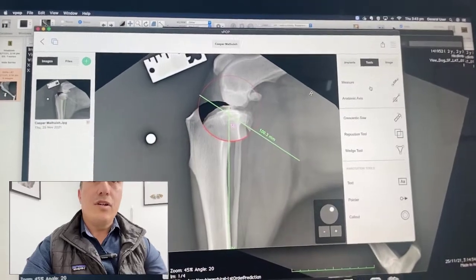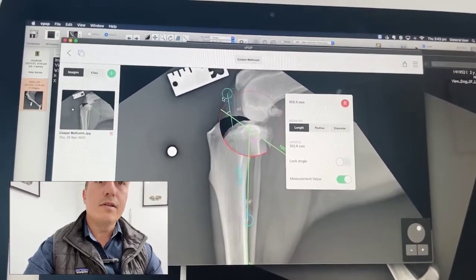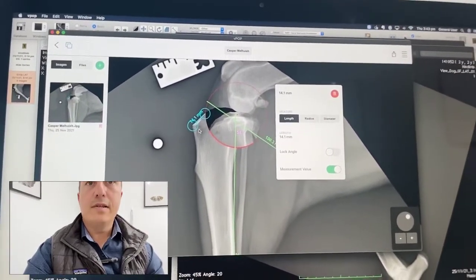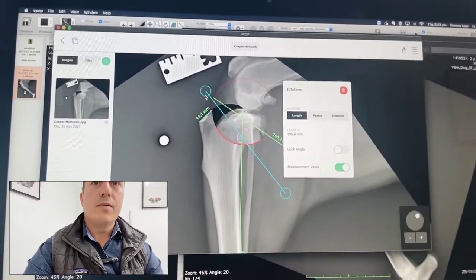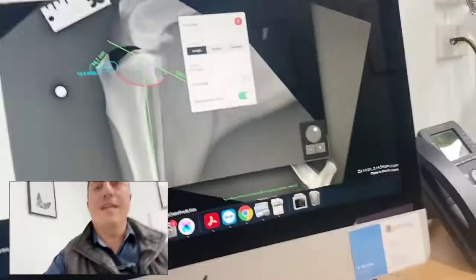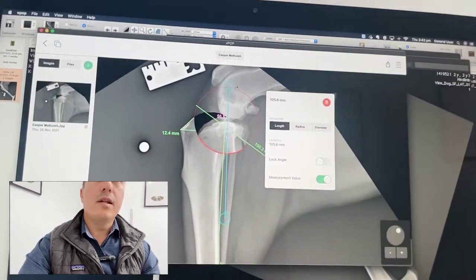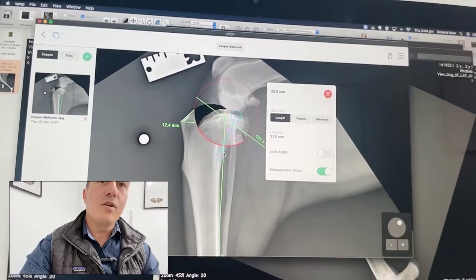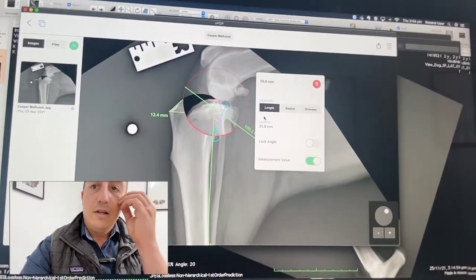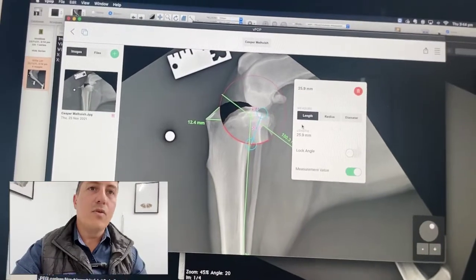The other thing we're going to do is measure so I know where to place the saw in surgery. I'm going to measure a couple of different lines. I'm going to measure this distance here, which is D2 — I've got 14 millimeters. I'm going to put another measurement in here, going kind of straight across — that's going to be 12 millimeters, and I want that to be at least 10 millimeters, so 12 should be more than fine. Then one more: from the region of the caudal aspect of the medial collateral ligament down to where we make our cut — that one is 25.9 millimeters. Based on that, we know exactly where to put our saw in surgery.